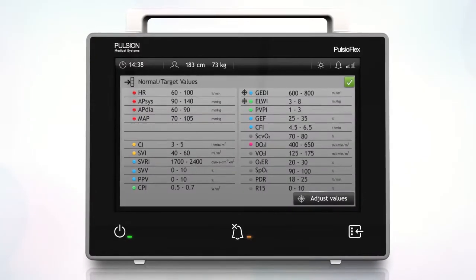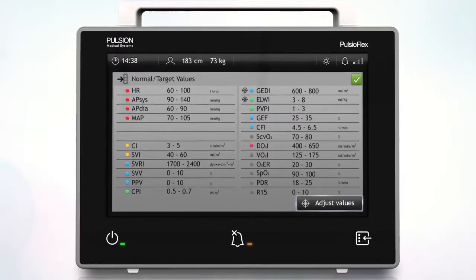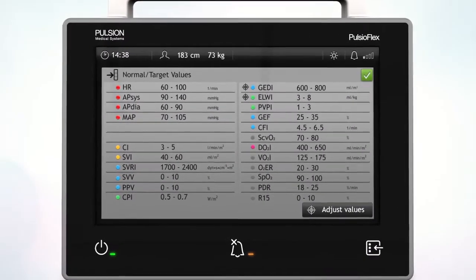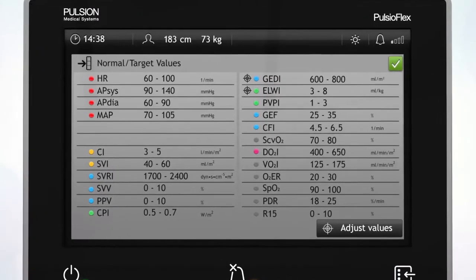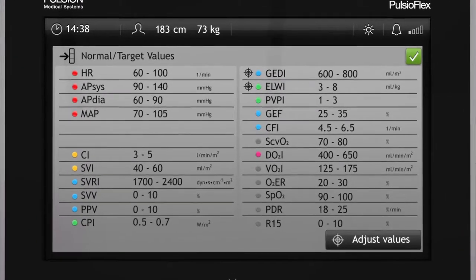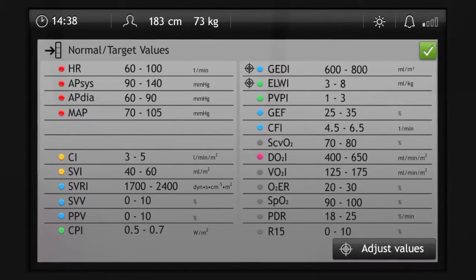Adjust Values opens the adjustment screen. If changes are made to a normal value, a target symbol appears next to the respective parameter.